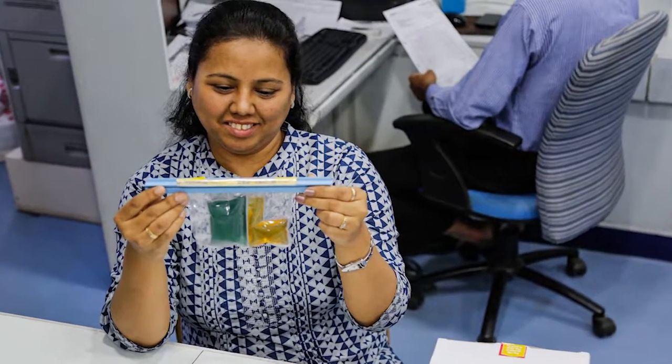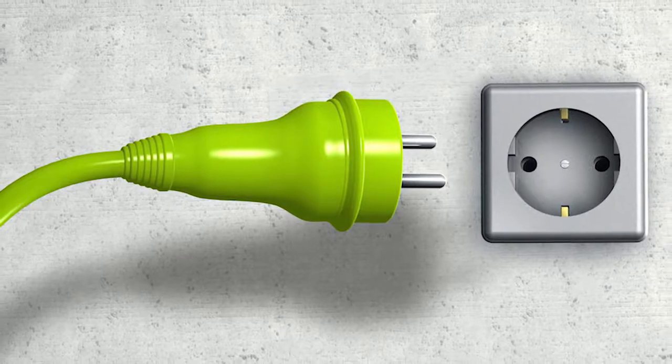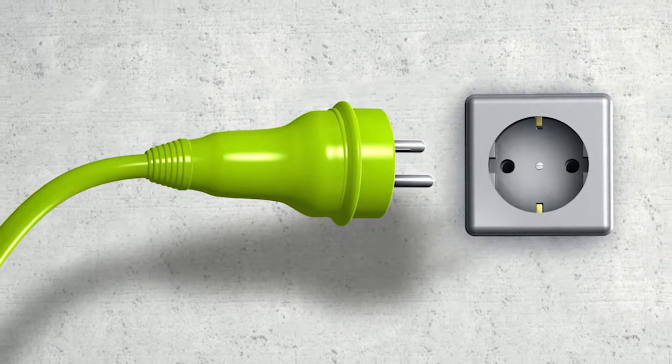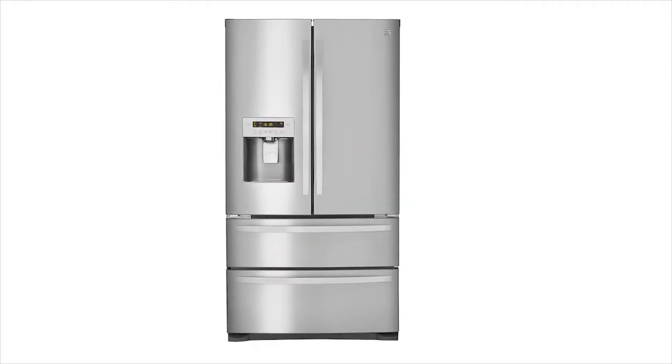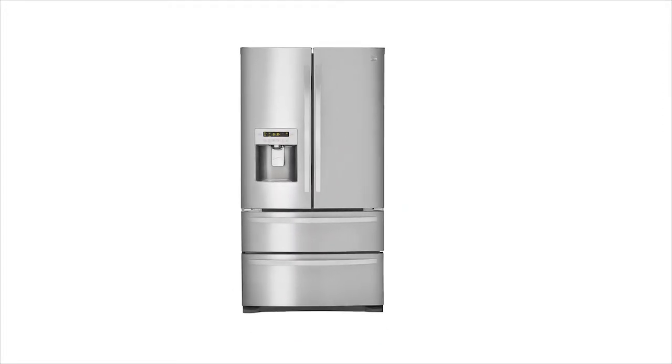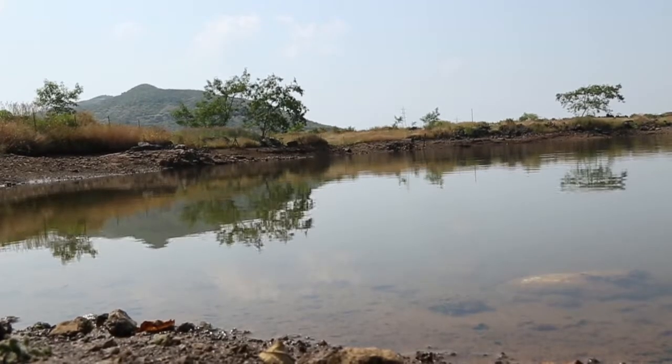Anyone with a minimal amount of training can use the HET. You don't need electricity, a lab, a refrigerator, or highly trained technicians. You can conduct this test anywhere, anytime.